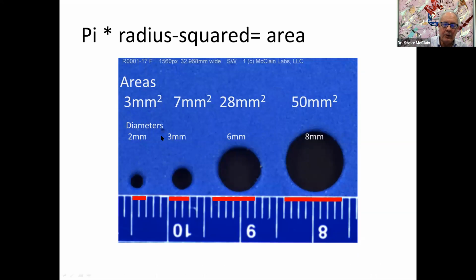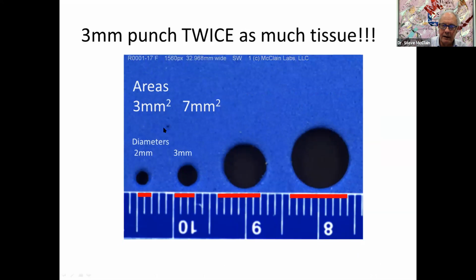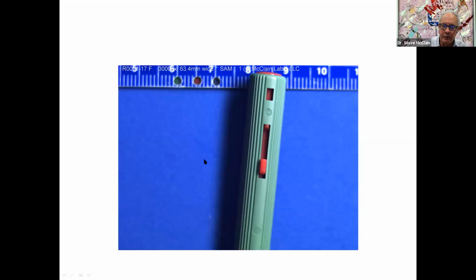If you ask a pathologist which they prefer, a 2 millimeter or a 3 millimeter, I can tell you almost uniformly will say 3. And there's a reason for that. Pi r squared, the 2 millimeter gives you about 3 millimeters squared of tissue, whereas a 3 millimeter gives you almost 7 millimeters squared of tissue. Twice the tissue in a 3 millimeter. Okay, a lot more room for error. There's always some crush artifact.